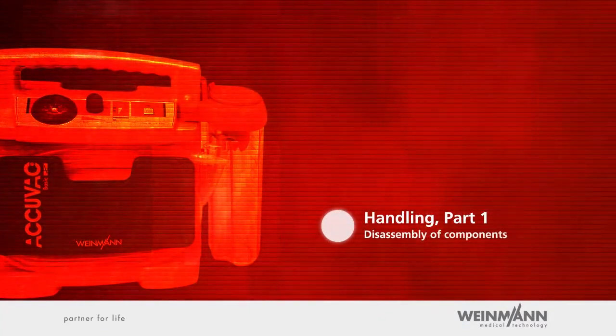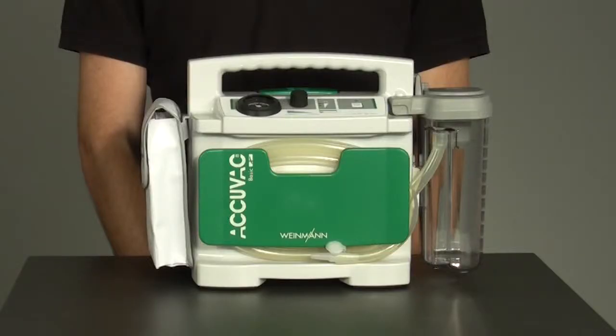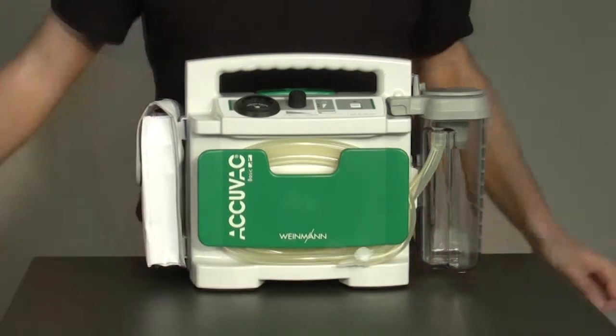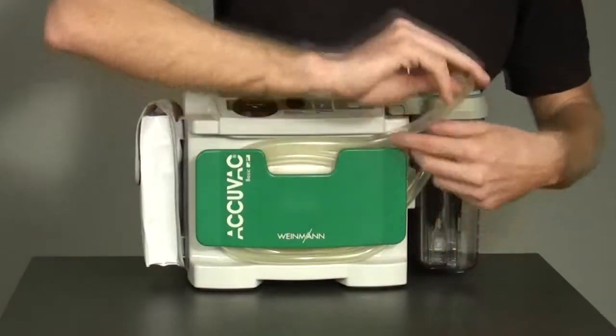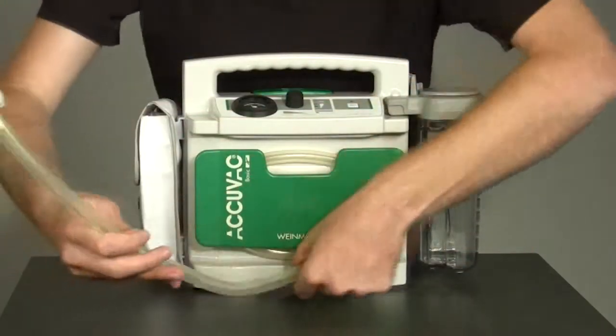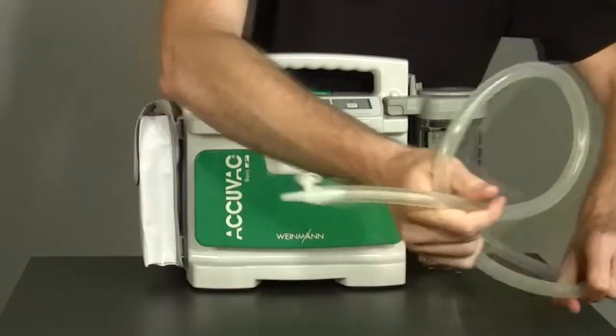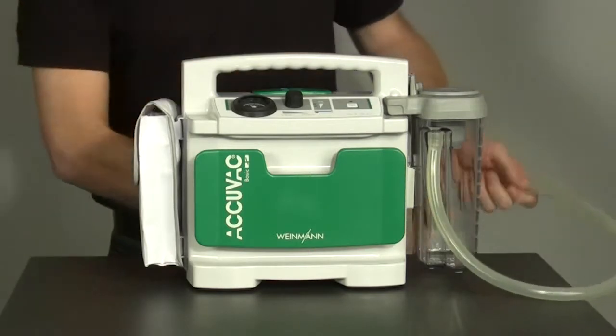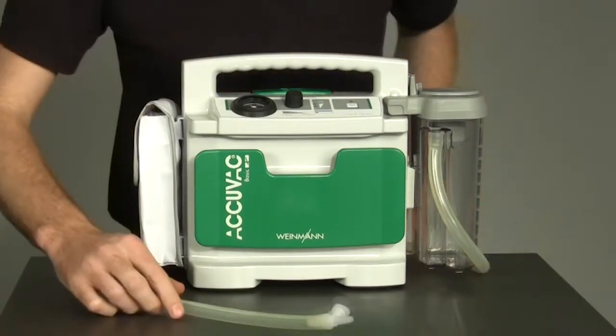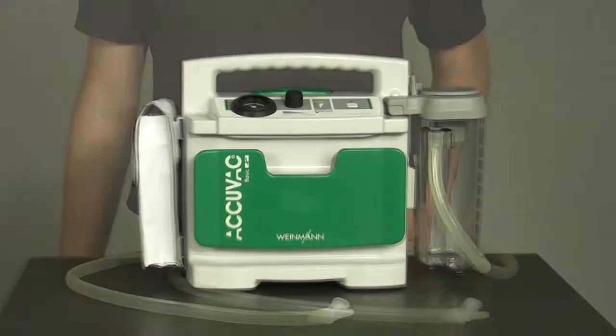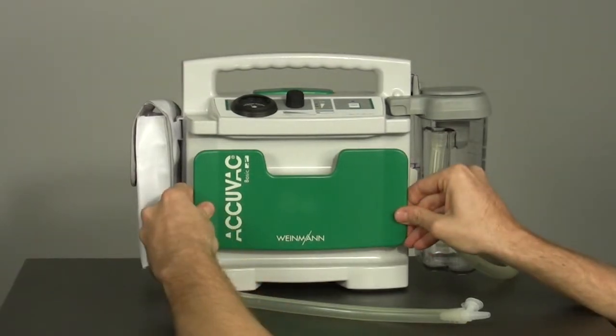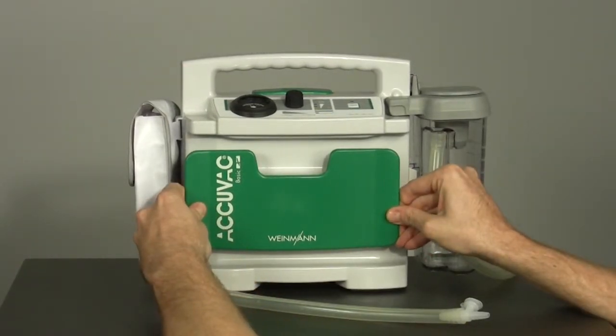Handling, part one: disassembly of components. For cleaning purposes, the major components can be disconnected from the motor unit. First, unwind the suction tube from the tube holder plate. Push the plate toward the left. You will have to overcome some resistance until you hear a click.